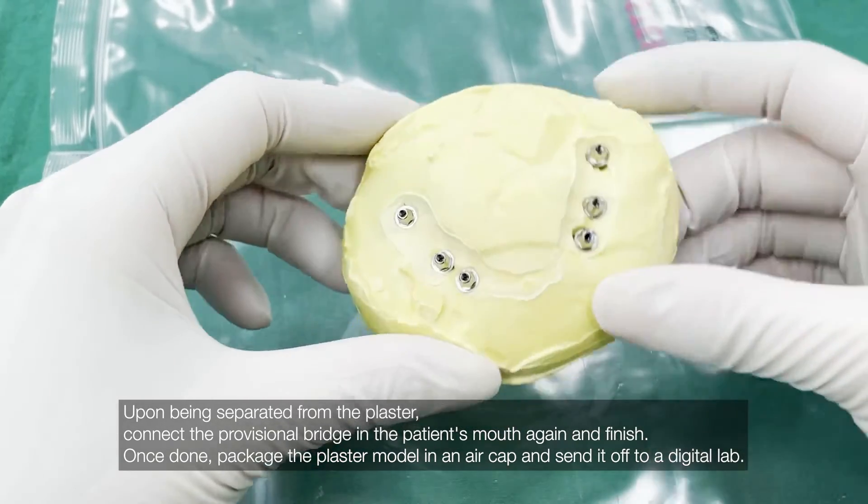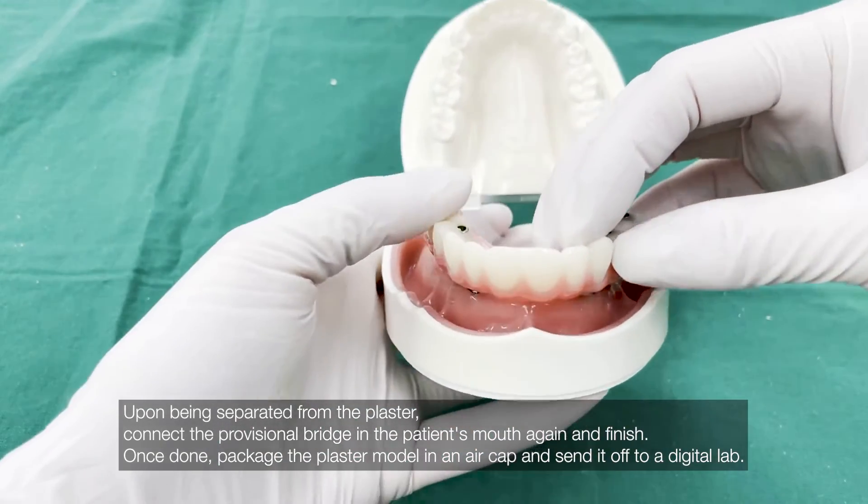Once done, package the plaster model in an air cap and send it off to a digital lab.